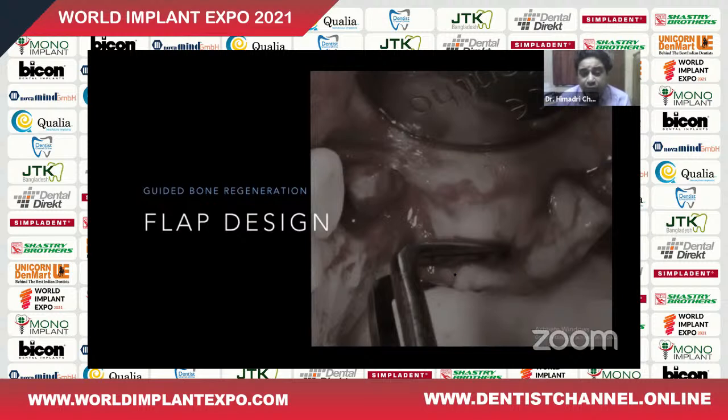Because if we cannot mobilize the flap, this is point number one, because remember, we are talking about the PASS principle, we need to get a passive closure. So for a passive closure, we have to have enough mobilized flap, otherwise we will not have a passive closure. It will be an active closure, and during healing, when there will be shrinkage of the overlying flap, the margin is open.